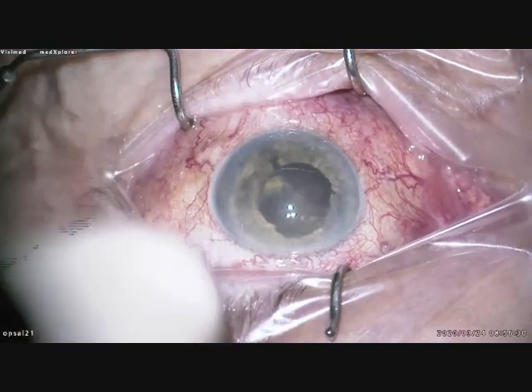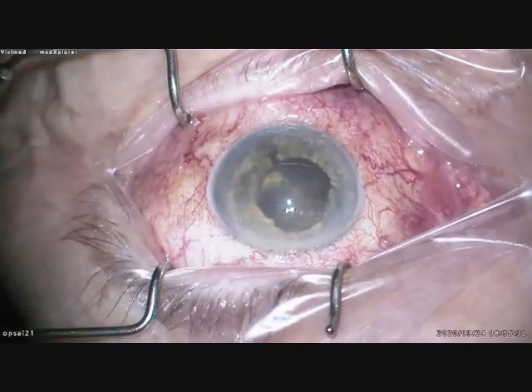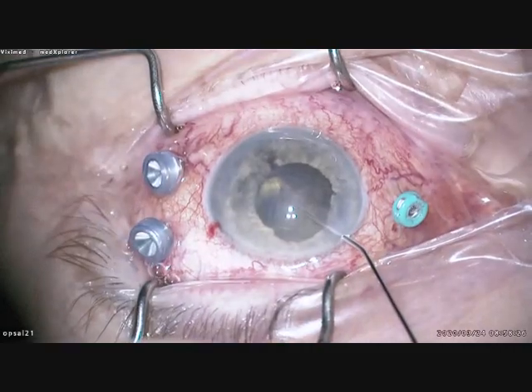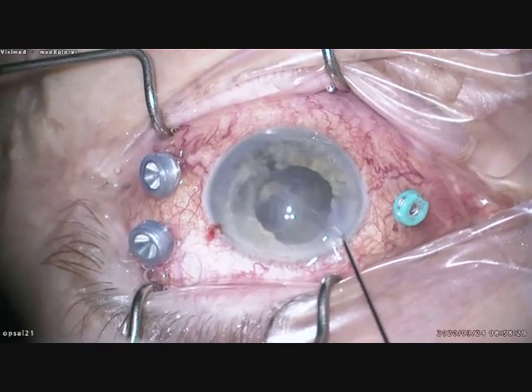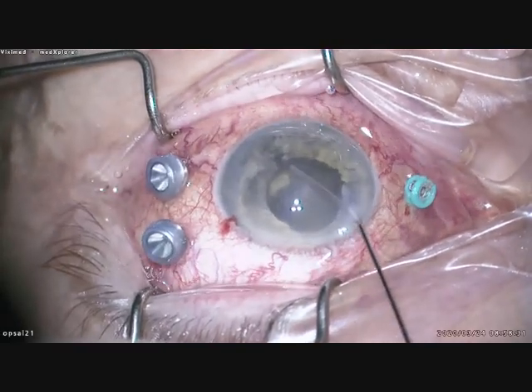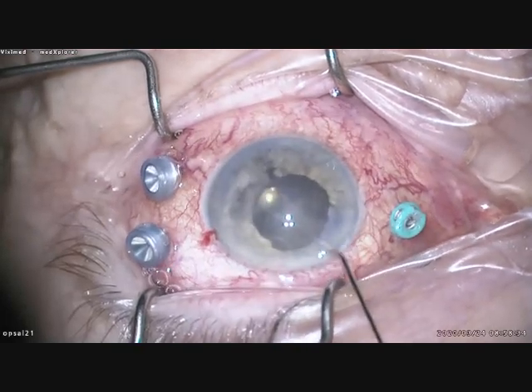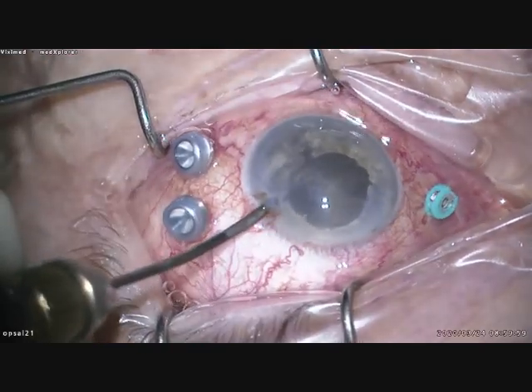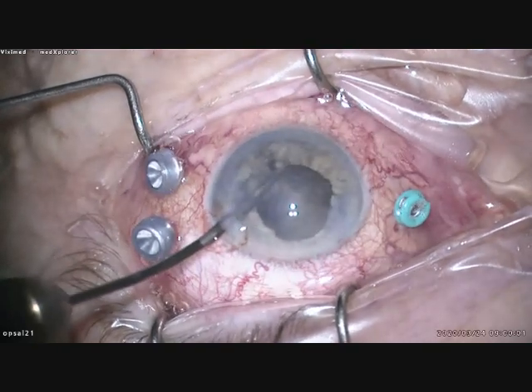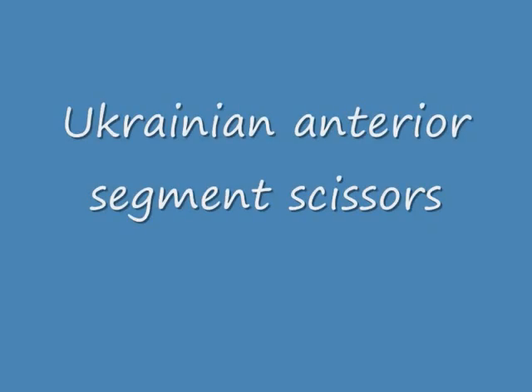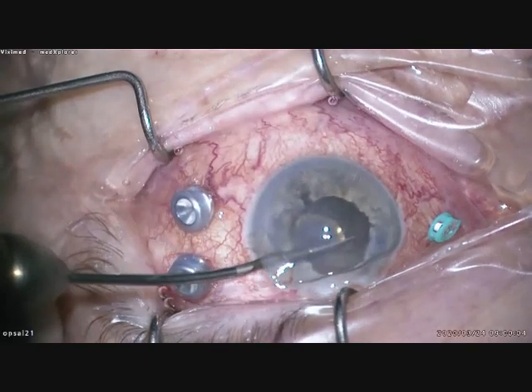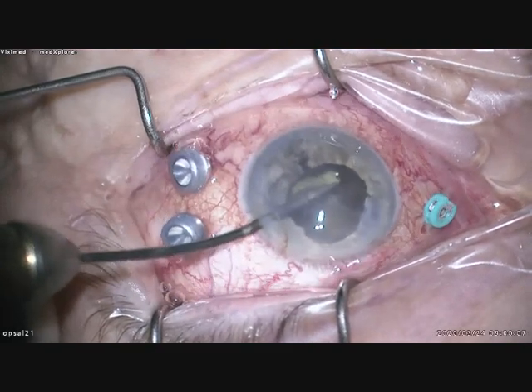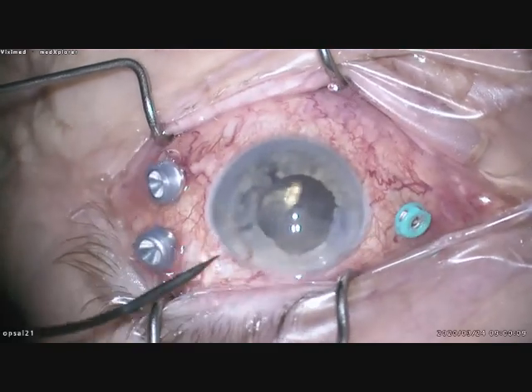Here again is the operative video. I'm trying now to remove the membrane in the pupil. This is a Ukrainian anterior segment scissors. I'm cutting the membrane — it is black.